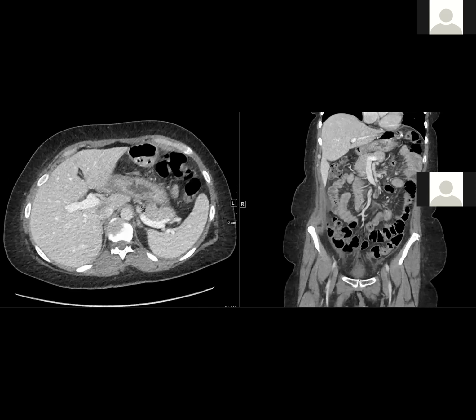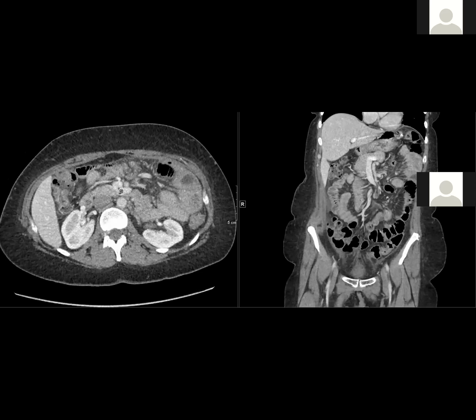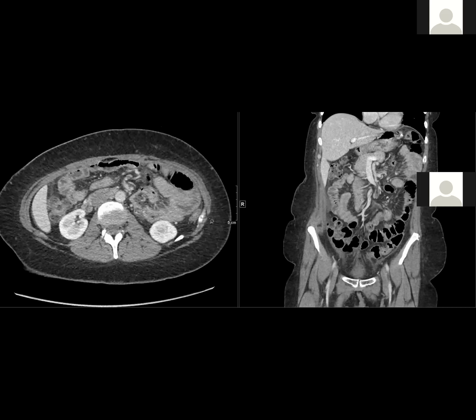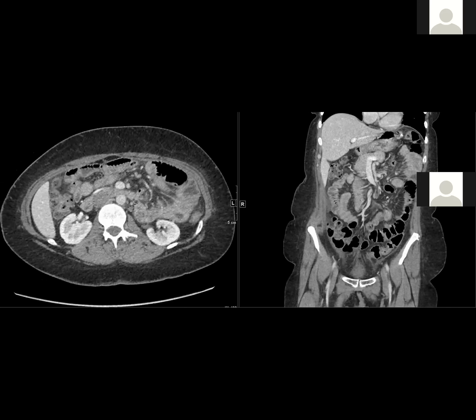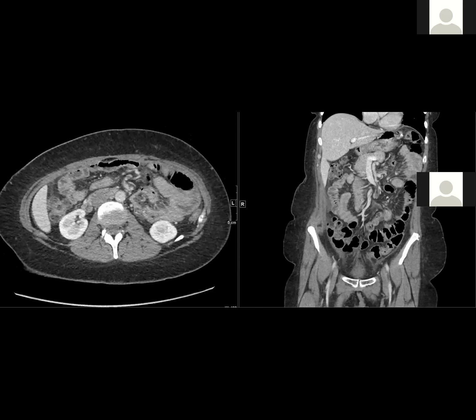And I'm also thinking that the SMV looks kind of kinked and pulled into possibly an internal hernia. So yes, this was an internal hernia. It was not obstructed, but if you see here, the SMV has this beaked appearance, and on the axials there is mesenteric swelling. So we suggested the diagnosis of an internal hernia. The surgeons were not very convinced because there was no obstruction, but the imaging features were quite supportive of that.